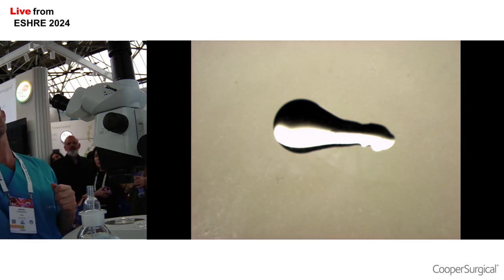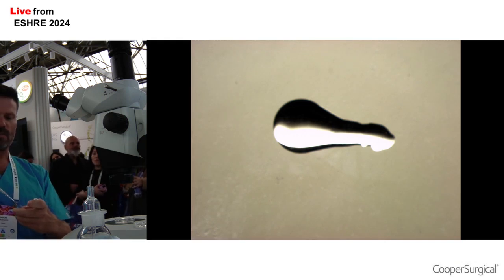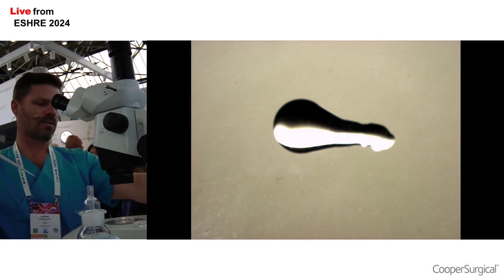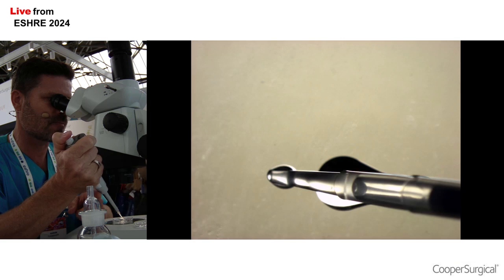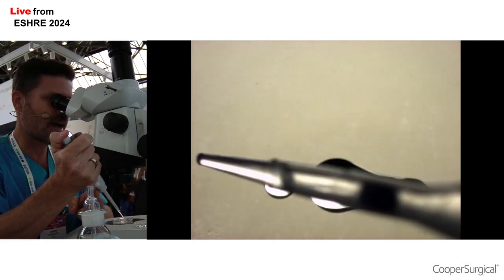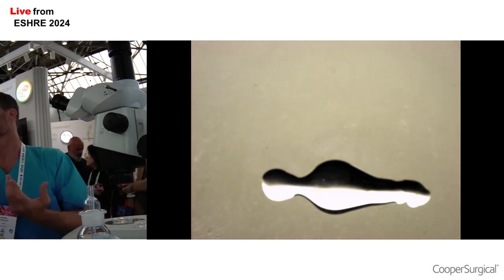Now, on the other side, the left hand side, I'm going to take a bit of my sperm preparation again, and the same again, I place one small drop. So this is my sperm preparation. And with my pipette, I'm just going to make a small bridge and join the two up there, okay?